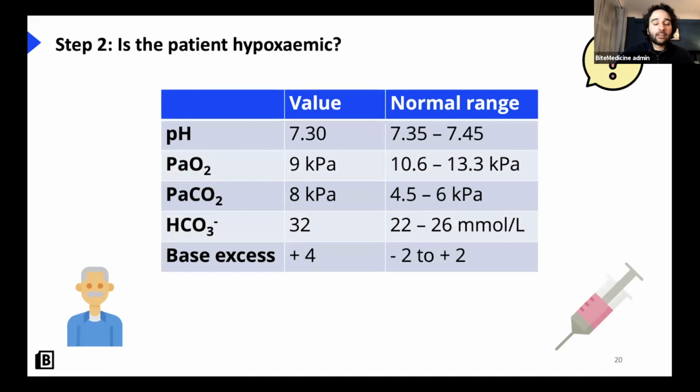Okay, back to our chap. Remember, he's come in with some chest problems. We're not sure what's going on. It could be COVID, it could be pneumonia, but we have a patient, he's hypoxemic, and well, we think he might be hypoxemic, and this is his arterial blood gas. You don't need to memorize that right now. Hopefully on Menti, it should come up again.